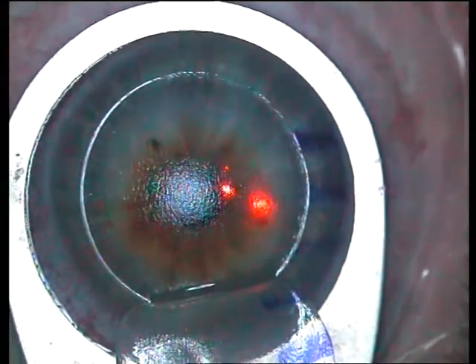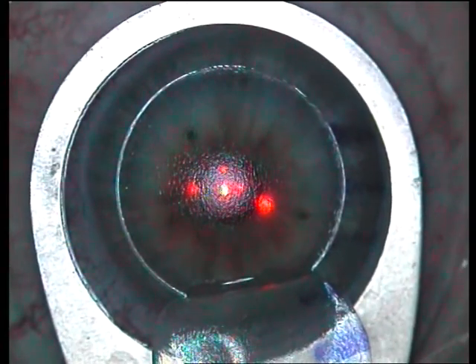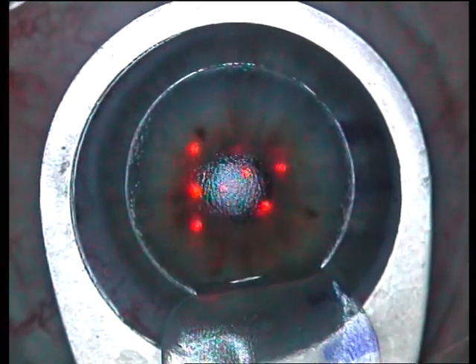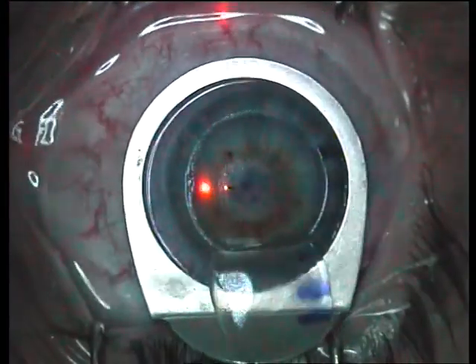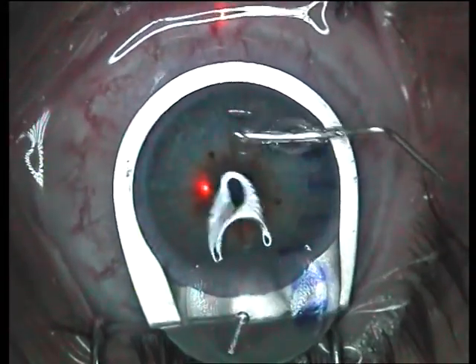The laser is focused and aligned. The patient is told to look straight into the laser fixation light and the laser has started. This is a flying spot laser. What the patient perceives is a glow of light, so you tell the patient to look into the center of the glow, whatever the color might be — usually it is red.